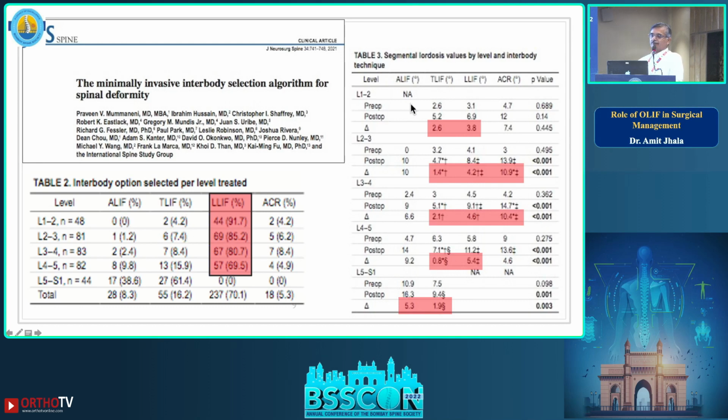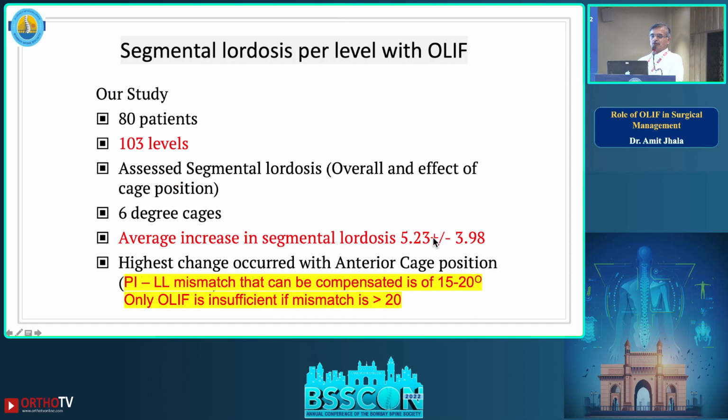And this is again a similar article where they have shown segmental lordosis values by level and interbody fusion. If you see the lateral fusions, it gives much more lordosis compared to the standard TLIF that we do. So there is no doubt that the OLIF works better.